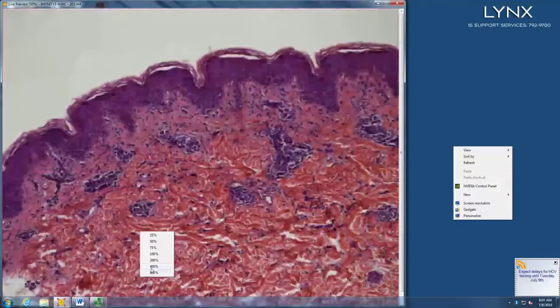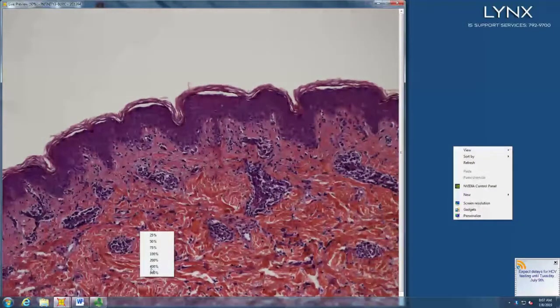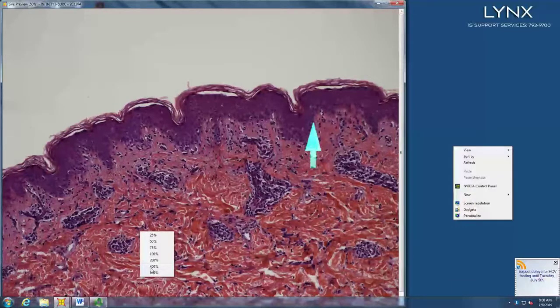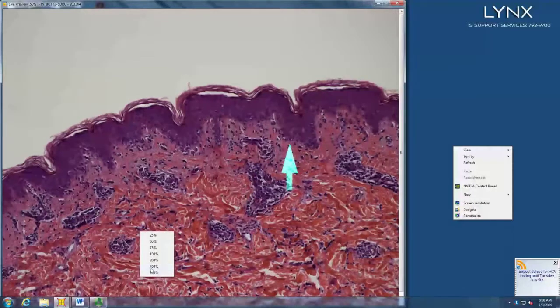And then what do you have going on here? It looks like a busy dermis, but it's a papillary dermis I'm hunting for. Okay, there's interface change. Interface change, and then are there holes out of proportion to lymphs, or is there a lymph in every hole? Oh, I didn't see that. There's a lymph in every hole. Lymph in every hole. So what do kids get that would have a lymph in every hole?